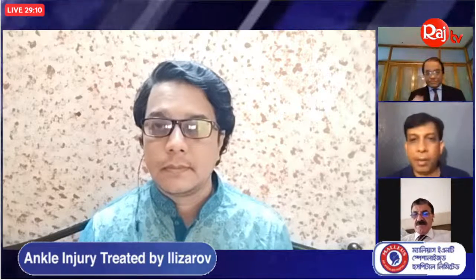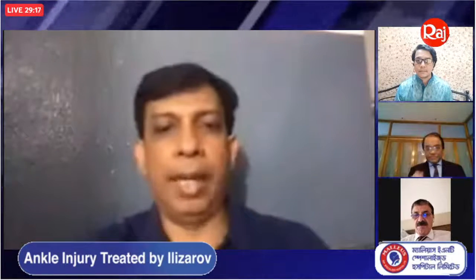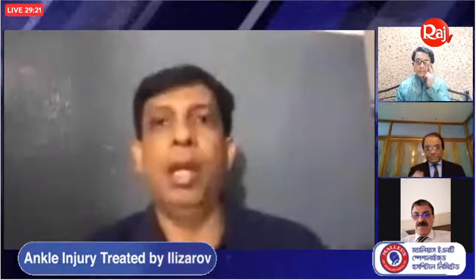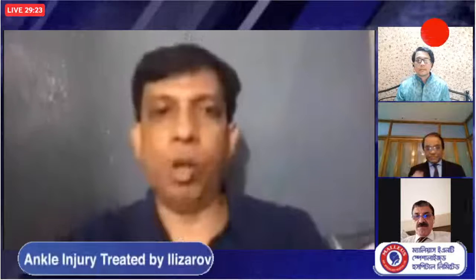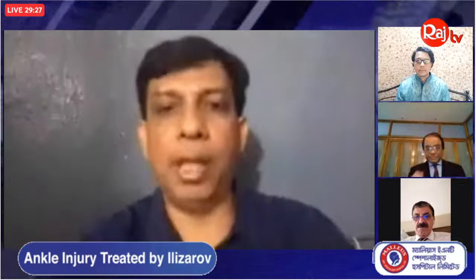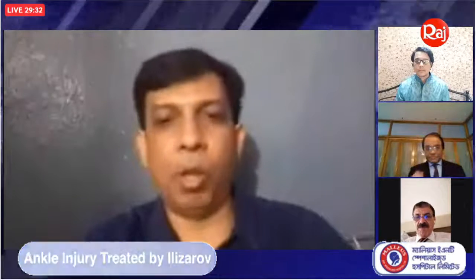Thank you, sir, for a wonderful presentation. We learned a lot from these presentations. In the ankle, I'm doing regular Ilizarov in my cases, especially when the fractures are compound. Closed fractures we do with plate or nail, but when there is a compound fracture, a primary Ilizarov gives excellent results, because plates and screws just give compression, they don't give distraction. With Ilizarov, it's always possible.